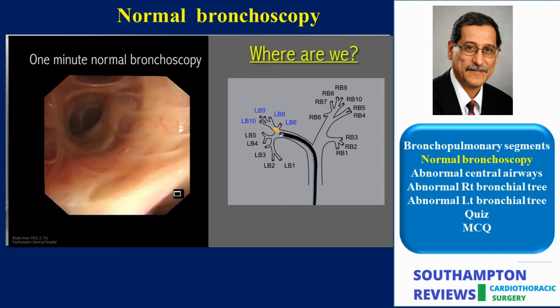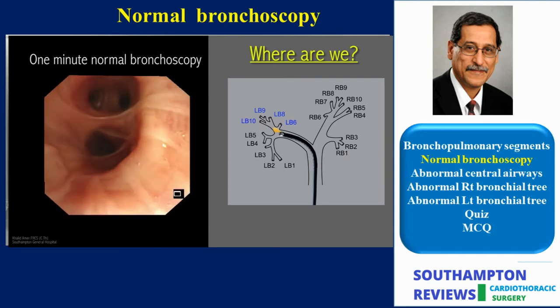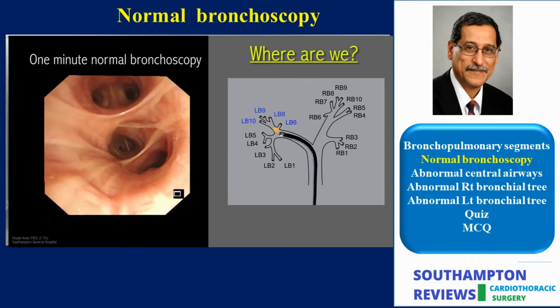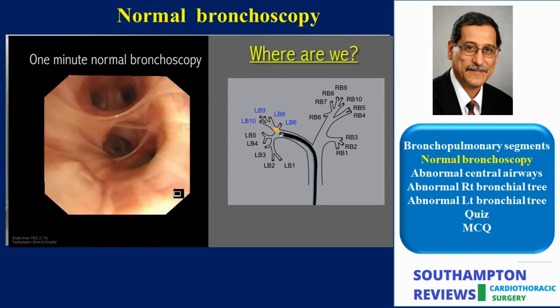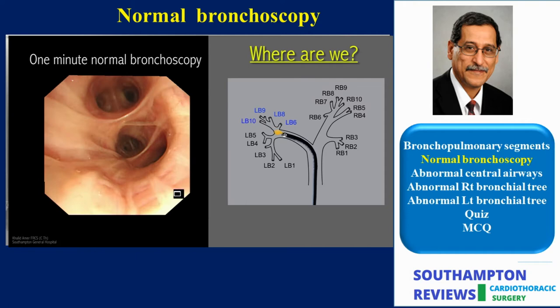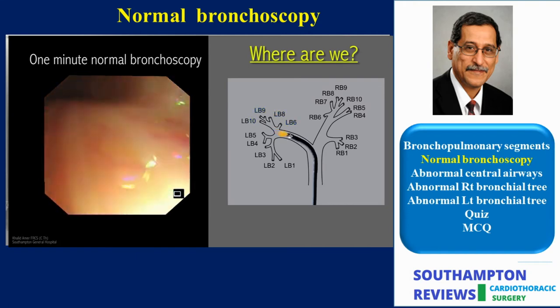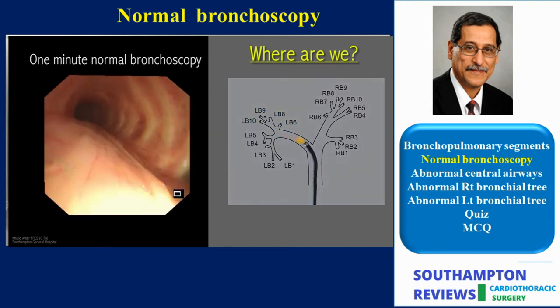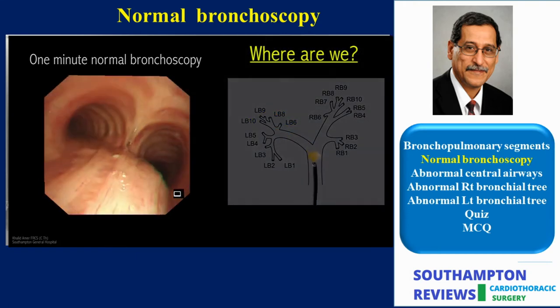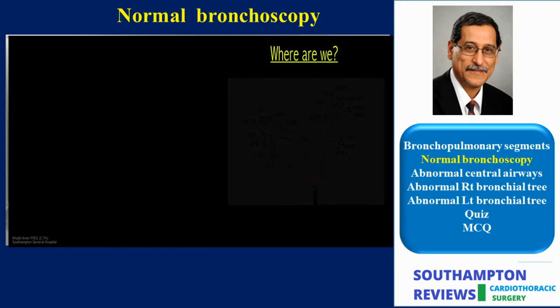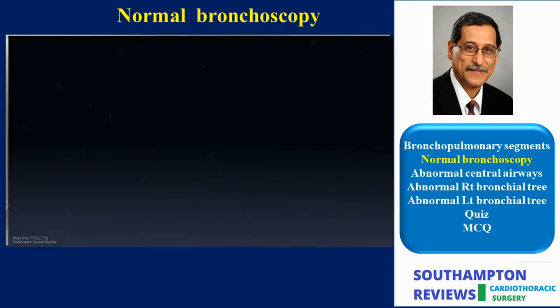Despite the fact that the operator could negotiate the slender 5 mm scope beyond the third level of divisions, the thoracic surgeon possibly has no great interest in that level of detail.